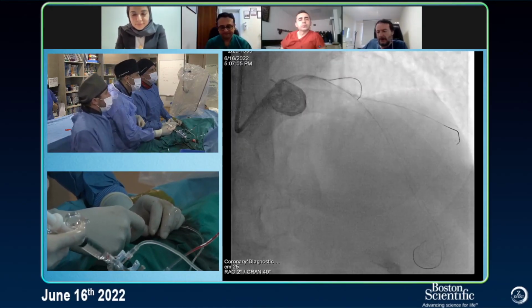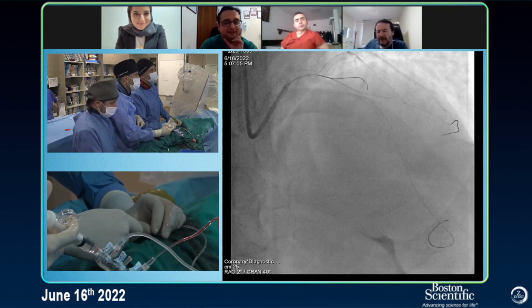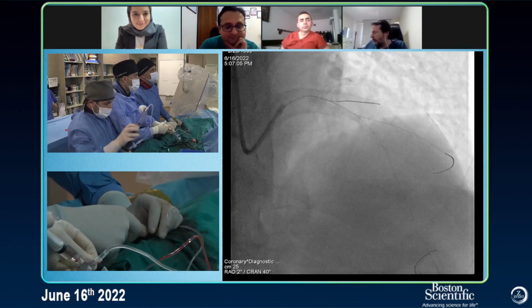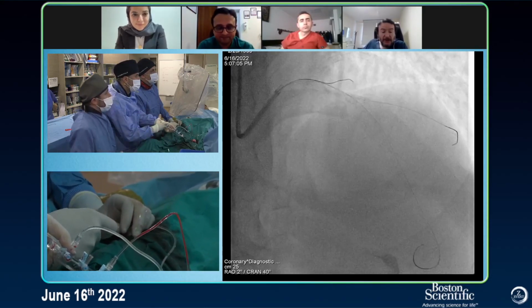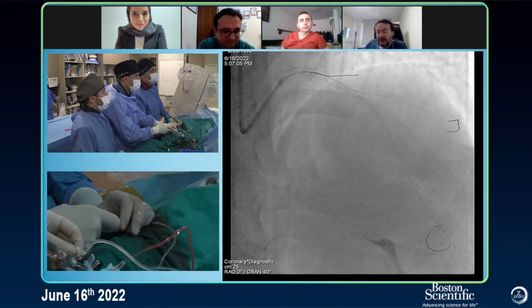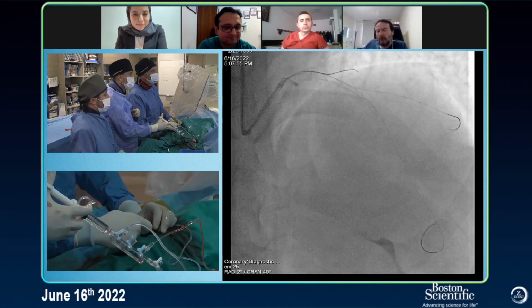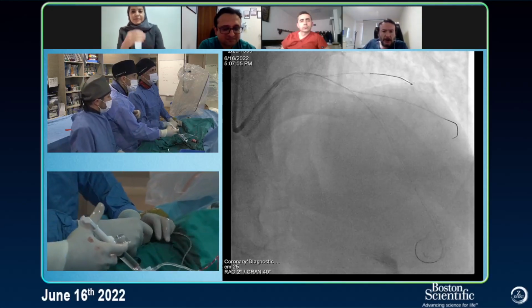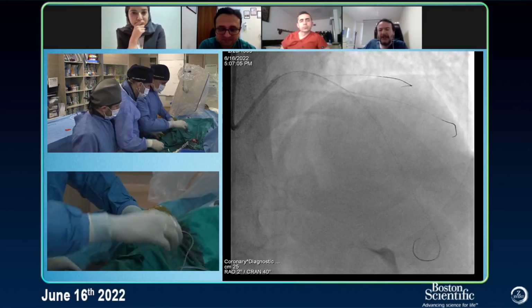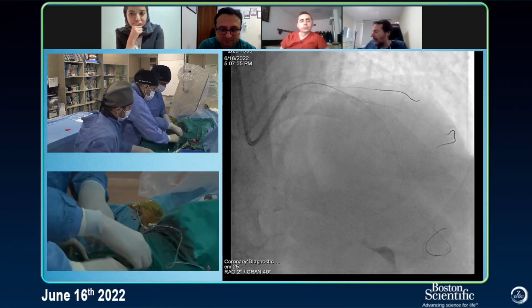By me it's up to my mood. If I want to work in a more aggressive manner, then I definitely go with the pacemaker. If this is a big RCA, and if I'm going there with a 2.0 burr and want debulking rather than modification, then I would go with the pacemaker.